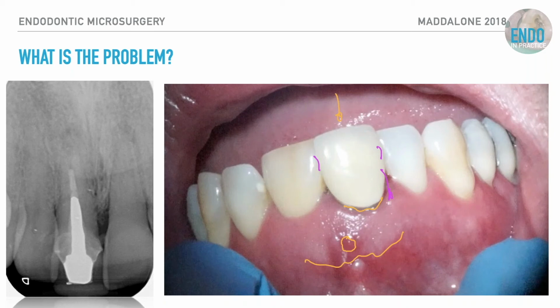And it's maybe more obvious when you look at the radiograph, but fundamentally, one of the things I always ask myself is, why was this root canal treatment, post-core crown, whatever it was, done in the first place? Because the adjacent tooth looks pretty intact, and the dentition itself is pretty well maintained. The most logical reason is trauma.